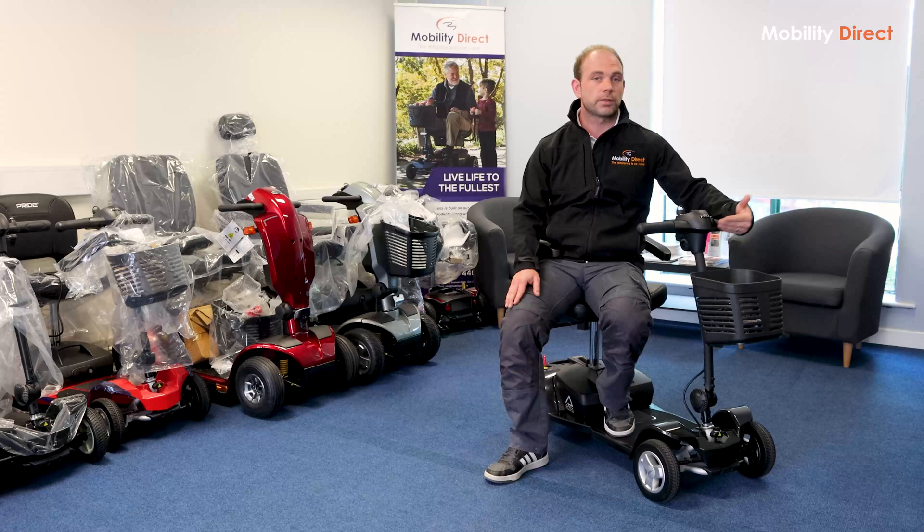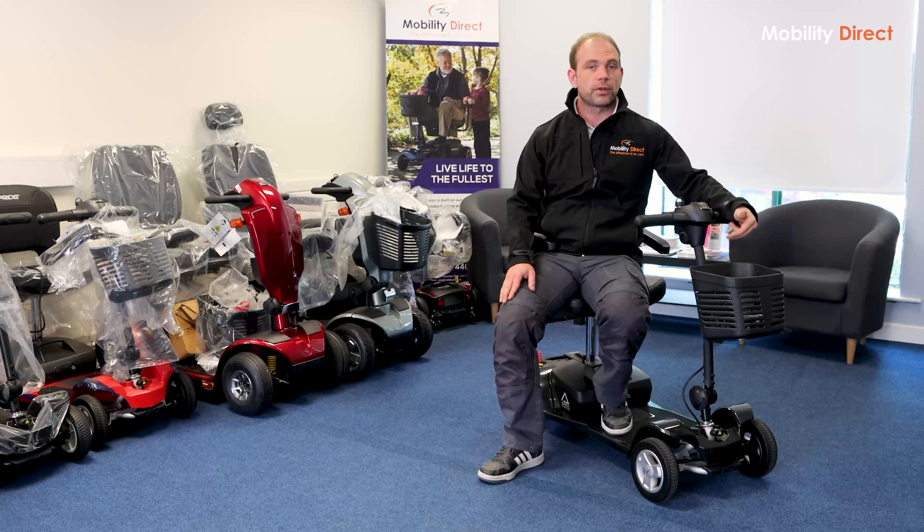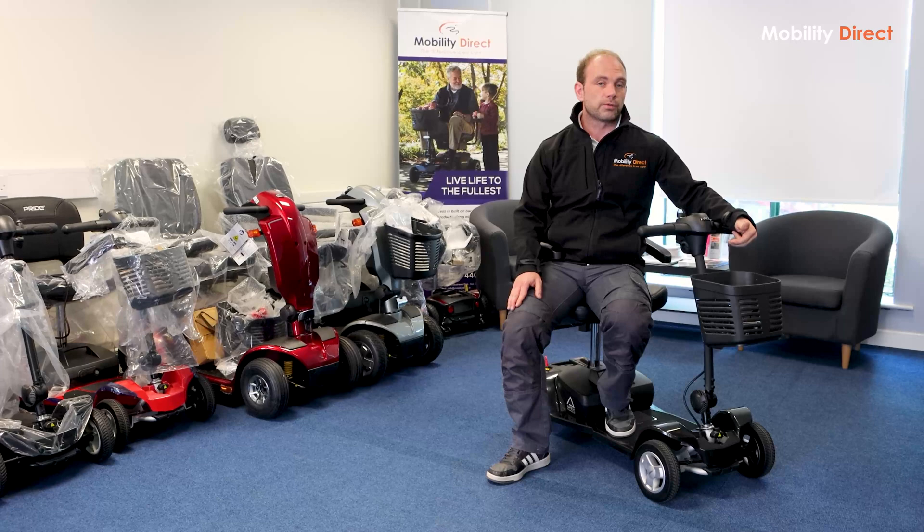If it's the case that you're going to be transporting the scooter on a regular basis, living in and out of the car, that kind of weight saving is going to be really, really noticeable. Generally speaking, the batteries tend to be one of the heaviest parts of the scooter when they're disassembled. So it's a big, big difference — a big saving on weight.